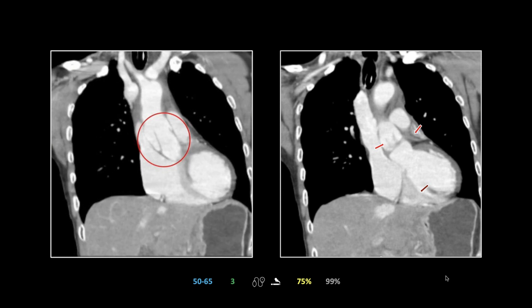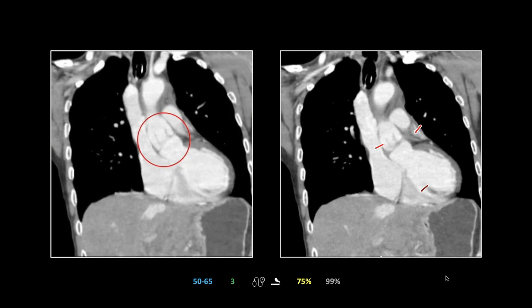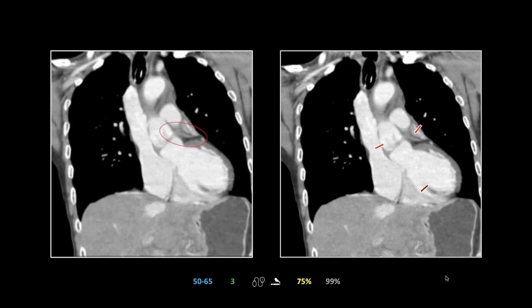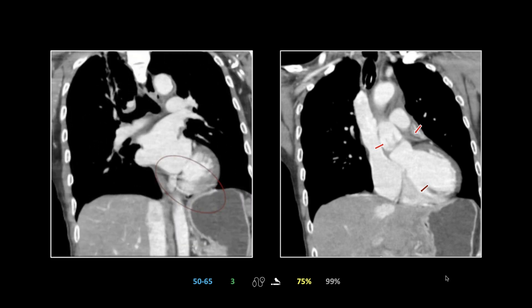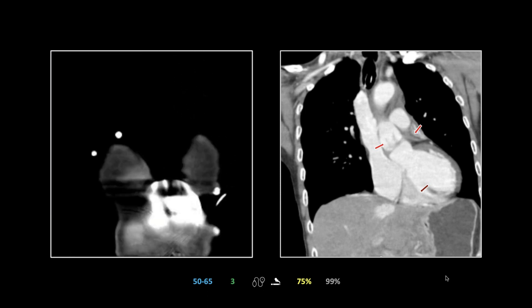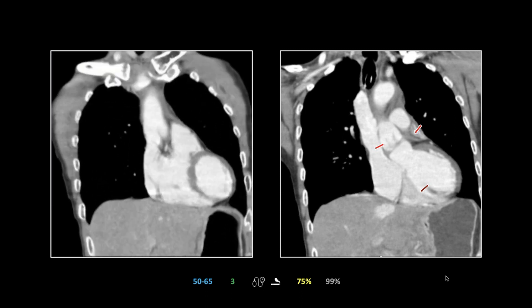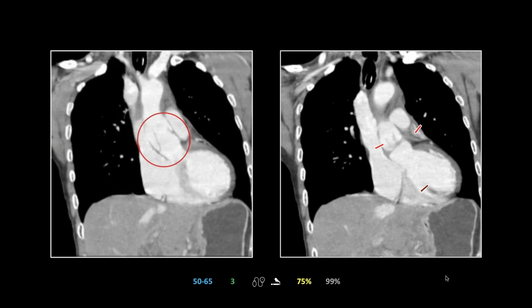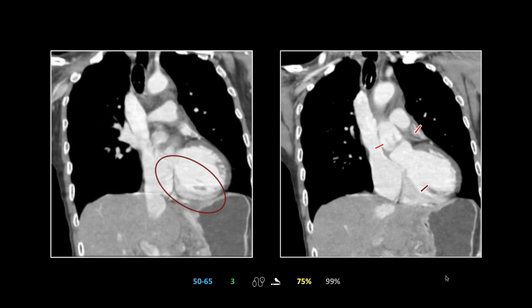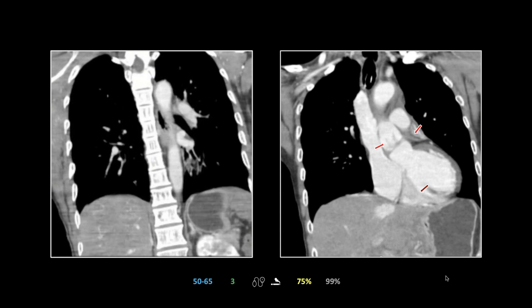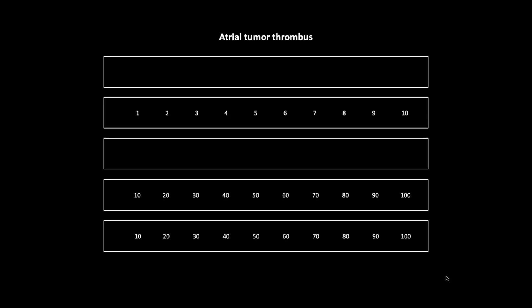On the coronals, you can watch the flap on the patient's left cross the ostium, and there's the left coronary system alongside the normal enhancing basal myocardium. That was an aortic dissection with coronary occlusion.